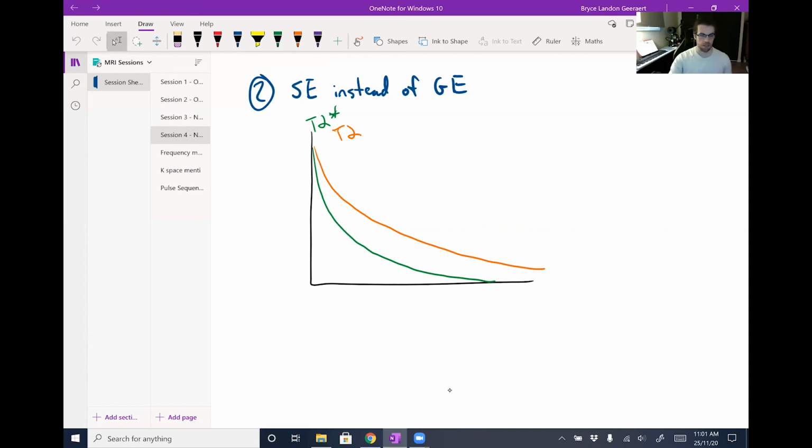Okay, second last question. What happens if we decrease our flip angle? The answer here, which most people got, is SNR decreases. So well done again. So far, we've been talking about 90-degree pulses pretty much exclusively. That'll change in a little bit. But the reason that SNR decreases when we decrease our flip angle is because we can only measure signal in the transverse plane, right?